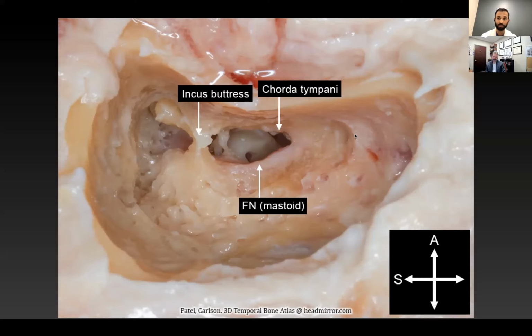In fact, not actually removing bone off the chorda either. I think it essentially forces people to lower the bone sufficiently. If you haven't thinned your ear canal enough, you won't see the chorda tympani nerve. And if you haven't lowered the bone on the facial nerve enough to the level of the horizontal canal, then you won't see that articulation either. So I think it forces you to get down to that plane.